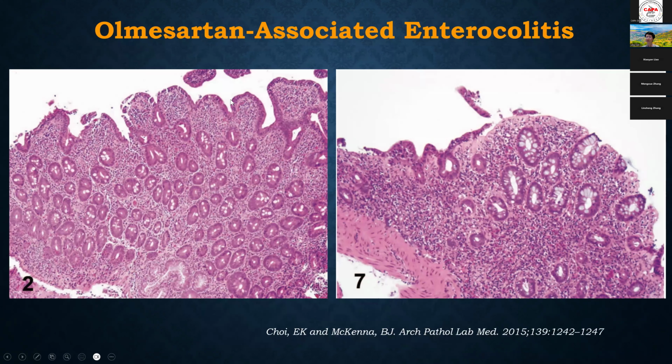And then the third drug is olmesartan, an anti-hypertension drug, and it can cause a variety of inflammatory patterns of injury, including IBD, and sometimes it can look like celiac disease, like this one. It can have villous architectural changes, some IELs, and a collagenous colitis pattern, and of course an IBD pattern. If you have an older patient with multi-organ involvement, you should think about olmesartan first, then IBD.